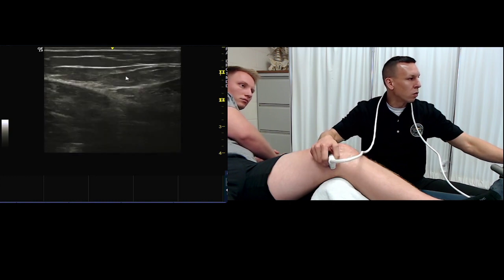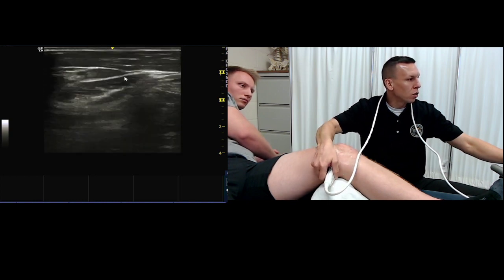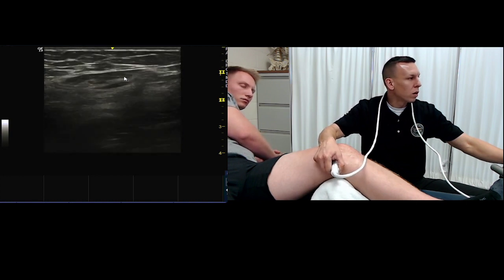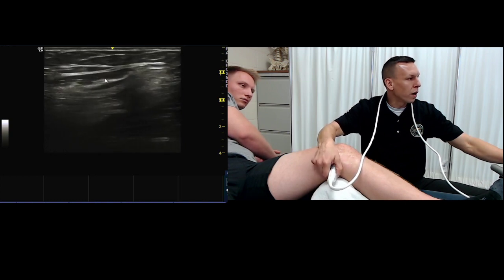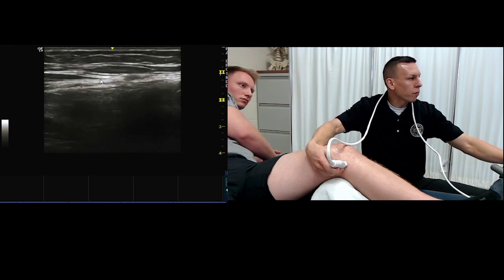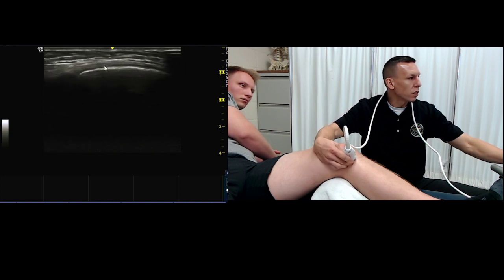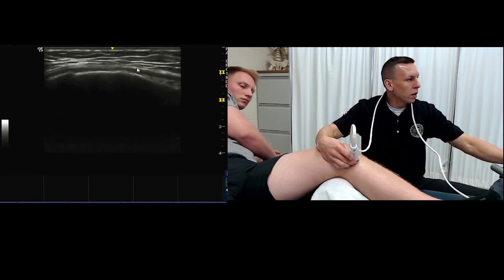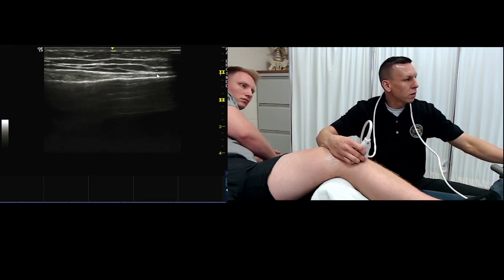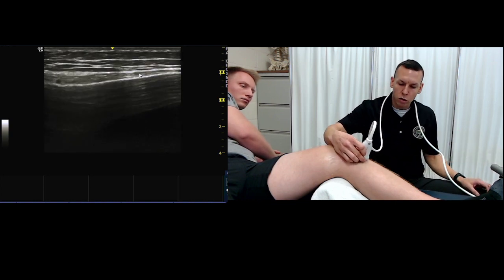Again, I'll do that again. So, if we are medial knee, and we'll do this again when we do the posterior knee, we'll do this a little bit more. So you'll have another opportunity to find these structures here. And you can take your probe into long axis and follow these structures here as they go over top of the knee, and kind of attach down onto the tibia here at the pes. And there's three of them obviously attached to that structure as well.